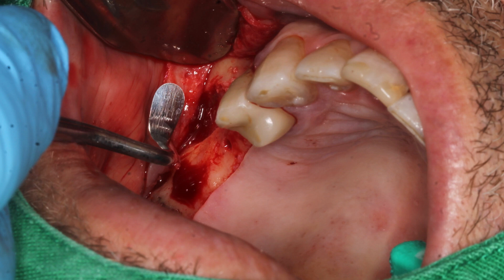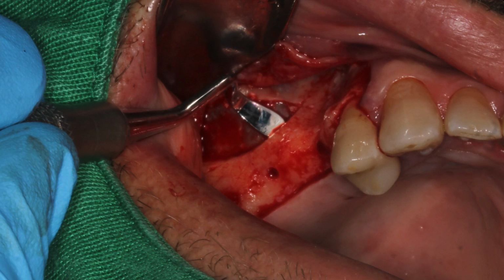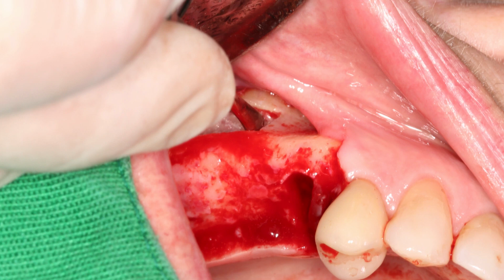In case you tear the membrane, I don't think it's a huge deal. My good friend Eric Park and I have written an article in 2023 on strategies of how to manage that. Please look that up. It's a very fine manuscript that describes all the different scenarios and the techniques used to overcome that complication if it should ever arise.